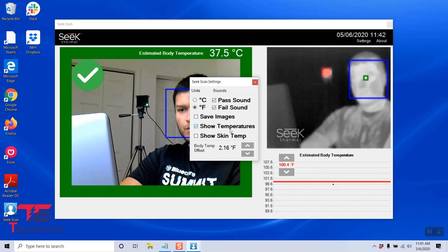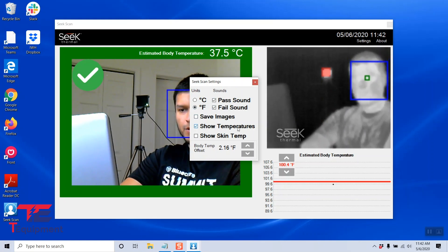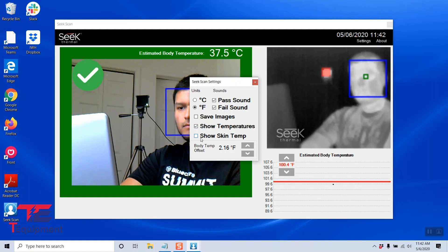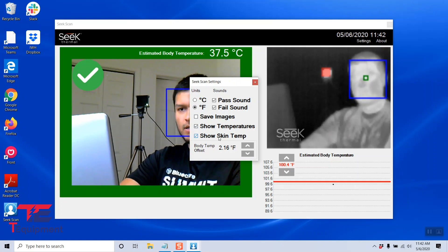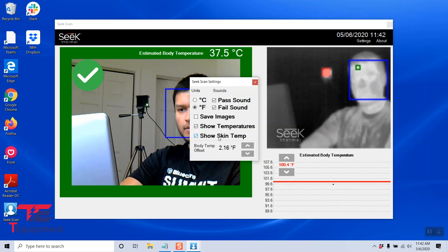I'm going to keep show temperatures. I do want to see the temperature. I'm also going to enable show skin temperature just to be able to see the skin temperature and the body temperature at the same time.